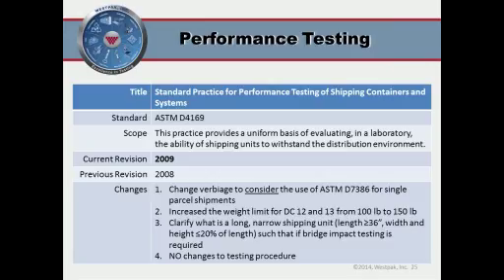That's why it has a lot of validity, in that it's important to get a non-biased view. You can't say to a truck, hey, be careful or be gentle because this is a medical device after all. I mean, people's lives are depending on this. Truck doesn't care. Aircraft doesn't care. The rail car doesn't care, guaranteed. So these procedures are important because they take that same ambiguity and apply it to any device or package that is going to ship. And it normally results in a very good decision-making process at the end, and that's why it's important.